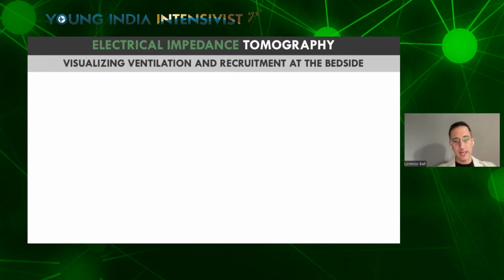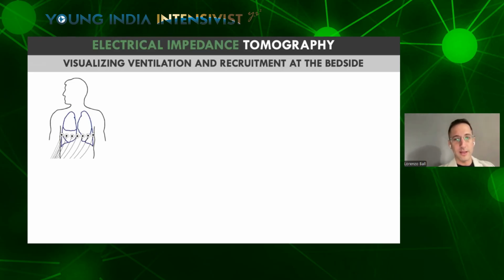Another tool that is gaining increasing popularity is electrical impedance tomography. We use it in our unit, but I must confess that so far I still perceive it as a tool mostly used for research and in many cases not much available in the real world, in several small hospitals or hospitals where there's no connection with the university and research activity.